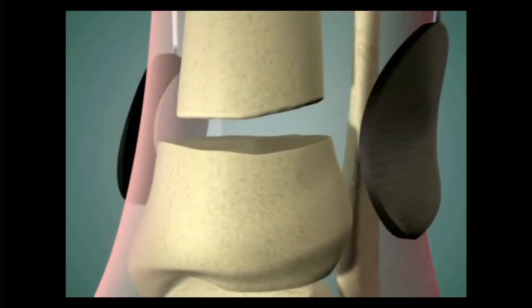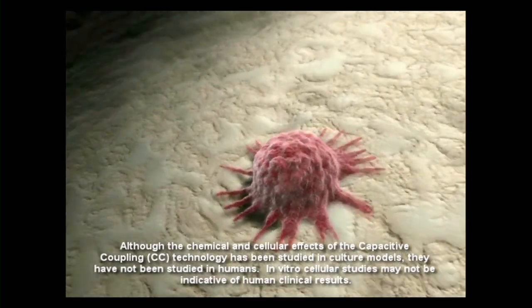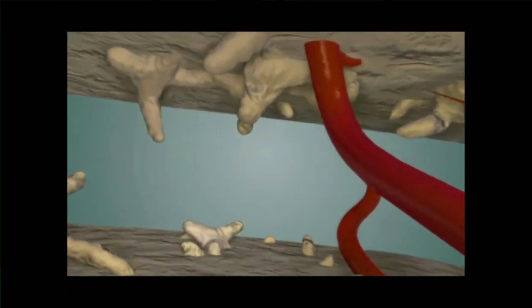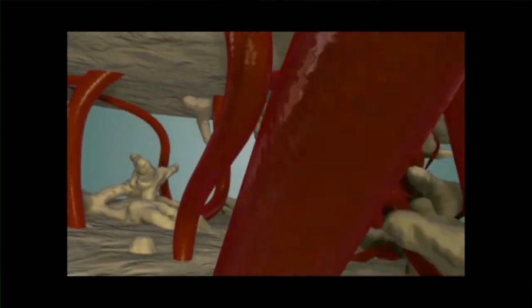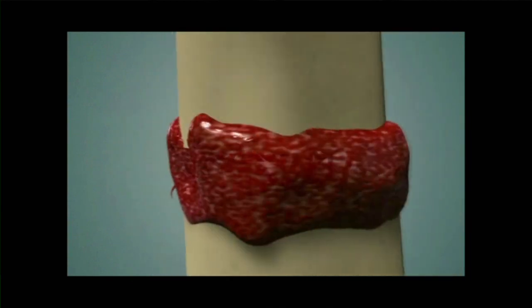In certain nonunions, having a bone growth stimulator may help to heal the fracture by providing an electrical treatment signal at the nonunion site. In certain nonunions, having a bone growth stimulator to help create the right electrical charge at the cell level will actually allow the nonunion to heal.